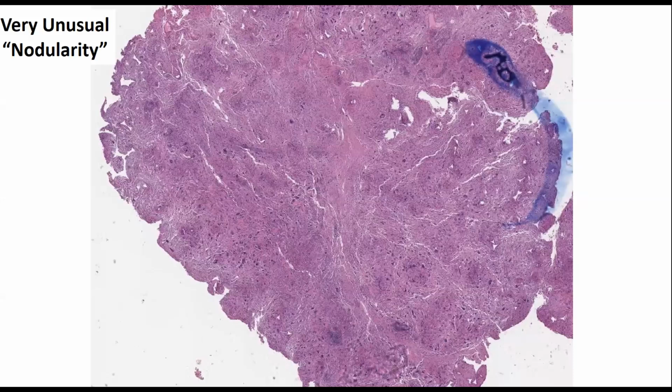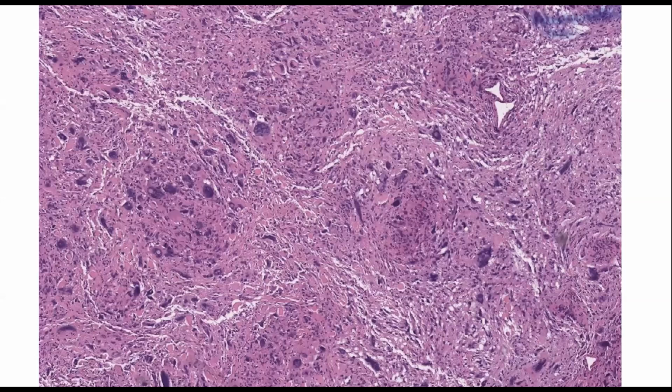All right, let's try it. You want to try one? This is an outside case. That's why you see that blue ink mark. Just ignore the blue ink mark. Now, here's what struck me when I was looking at this case. This was one of a dozen outside cases, just coming through on the day. We're moving through them one after the other. And it just struck me, there's like this nodularity to it. It's almost three-dimensional, like little hills and valleys. And what kind of grabbed me is that they're evenly, at a regular spacing.